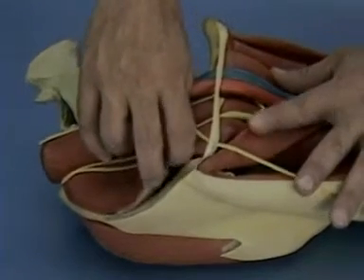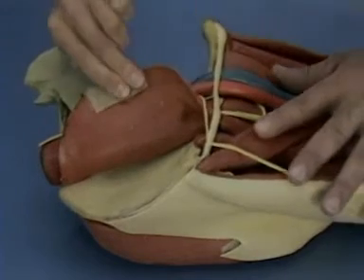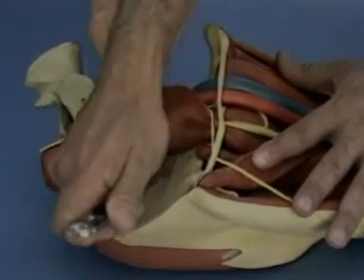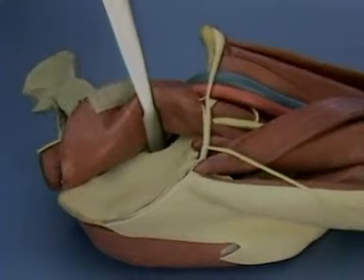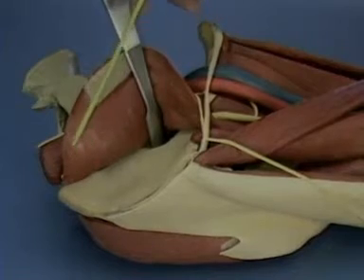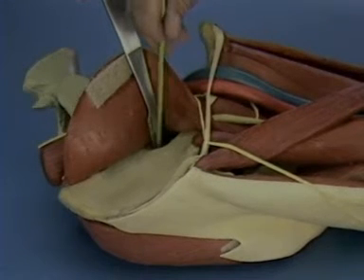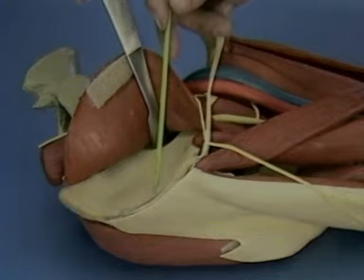The first window of the ilioinguinal is opened by reflecting the iliopsoas muscle and the abdominals in a medial direction. A Hohmann retractor is placed with a tip over the pelvic brim. The entire internal iliac fossa is now exposed, along with the anterior sacroiliac joint, the upper portion of the pelvic brim, and the upper portion of the anterior column.